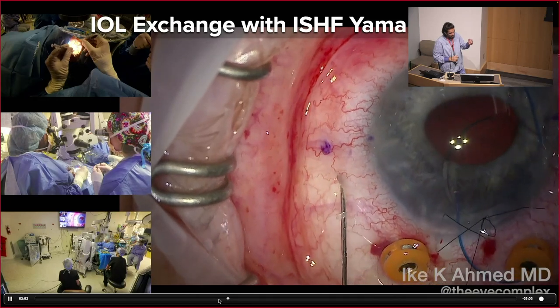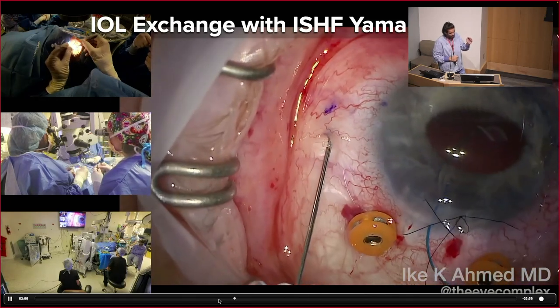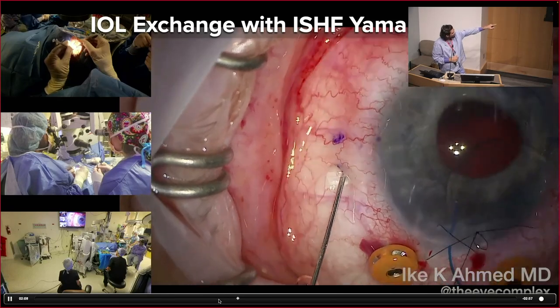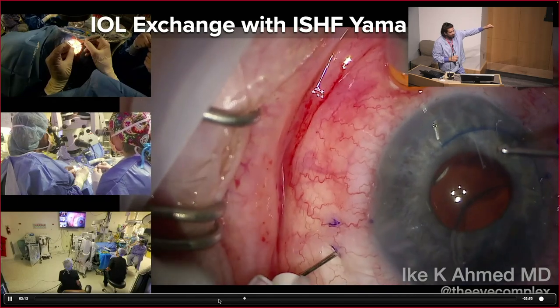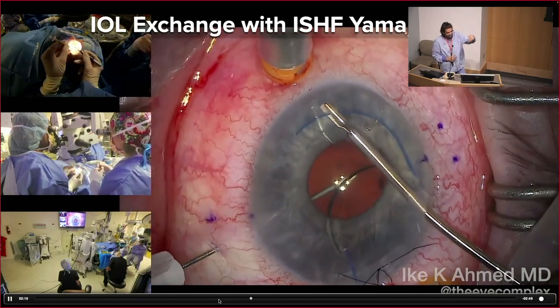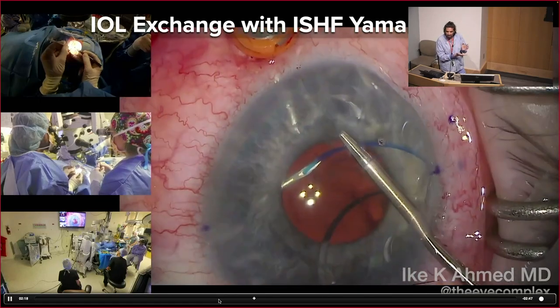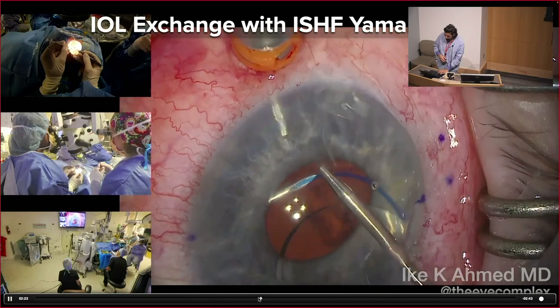So now the needle is being placed at about a 20-degree angulation, going fairly flat toward that second dot, and now you see that the sleeve of the iris hook is at the conjunctival interface. Now we can go in. We're trying to get manufacturers to actually mark these needles with a 2 millimeter mark, so we can know where we are. It's harder said than done, apparently. But that's one little tip.